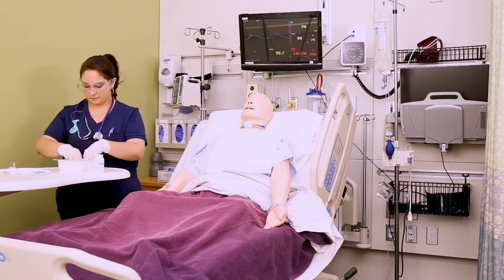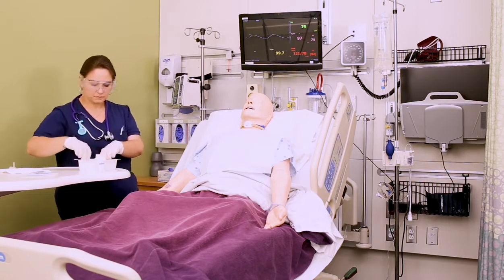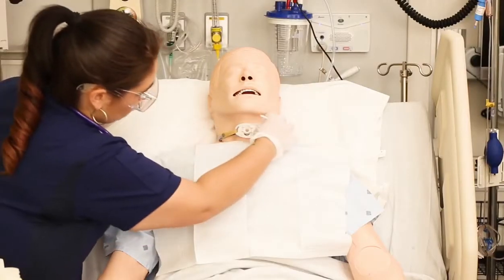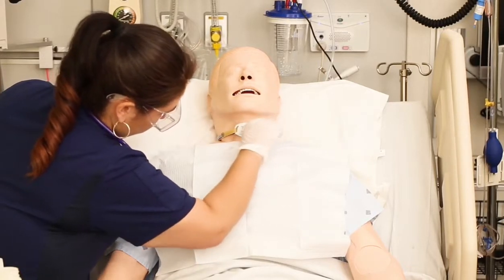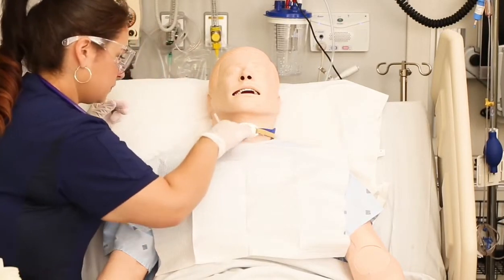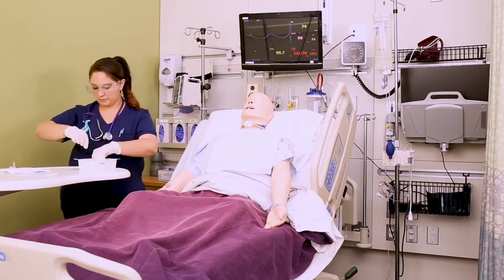So you'll use a combination of cotton tipped applicators and pipe cleaners, just depends on what you have in your kit. So just remember, you never insert these into the stoma itself. If needed, you can dip them in the saline solution and you're just going to scrub around the flange.